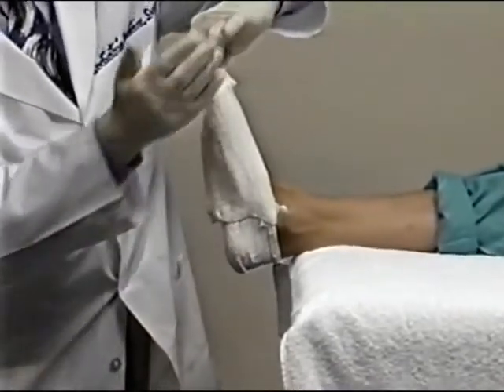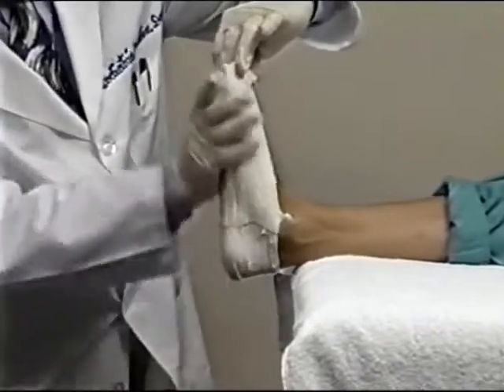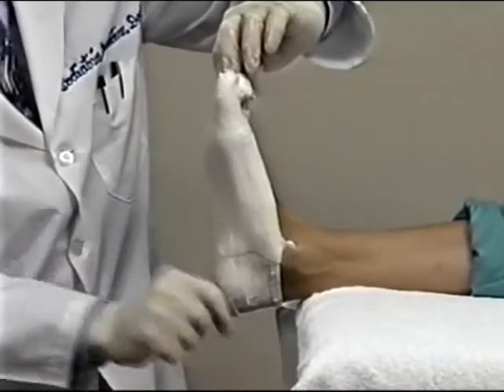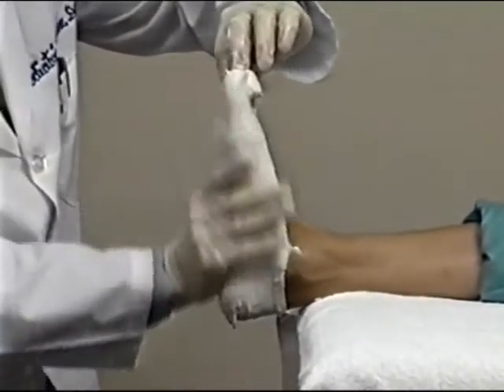Then tuck and smooth the medial side. Make sure the entire plantar aspect of the wet plaster splints are in contact with the skin, without wrinkles and without trapping air bubbles beneath the plaster.